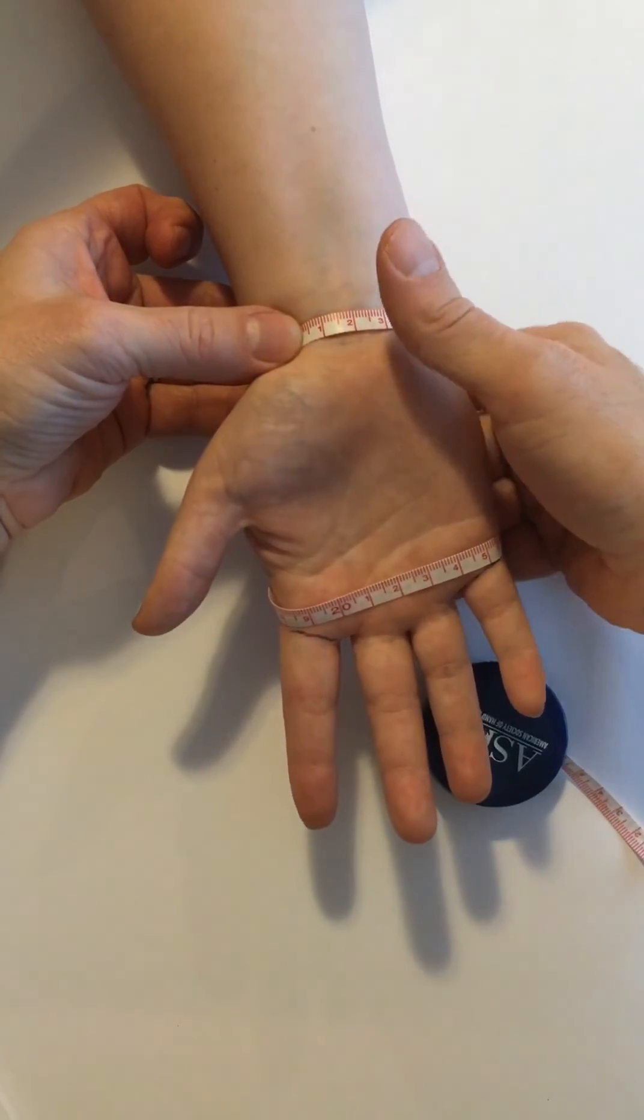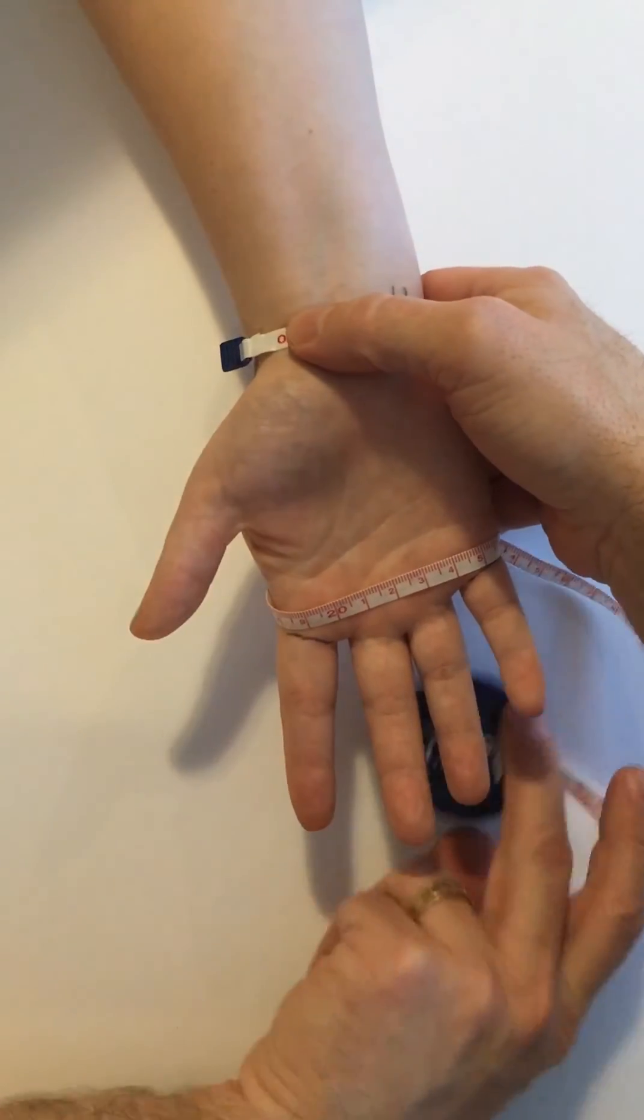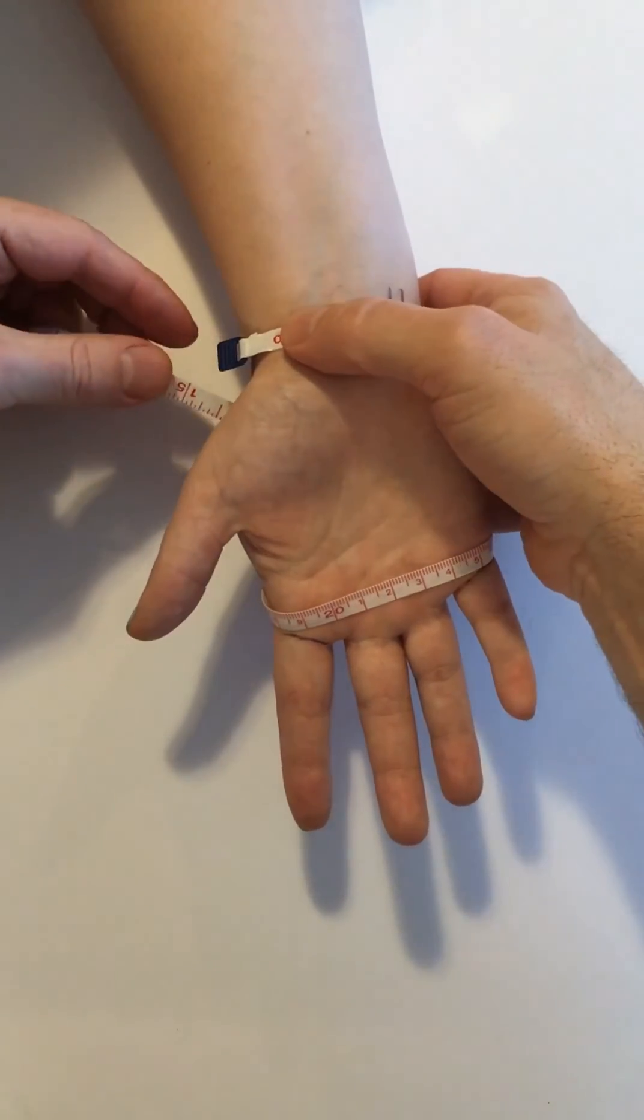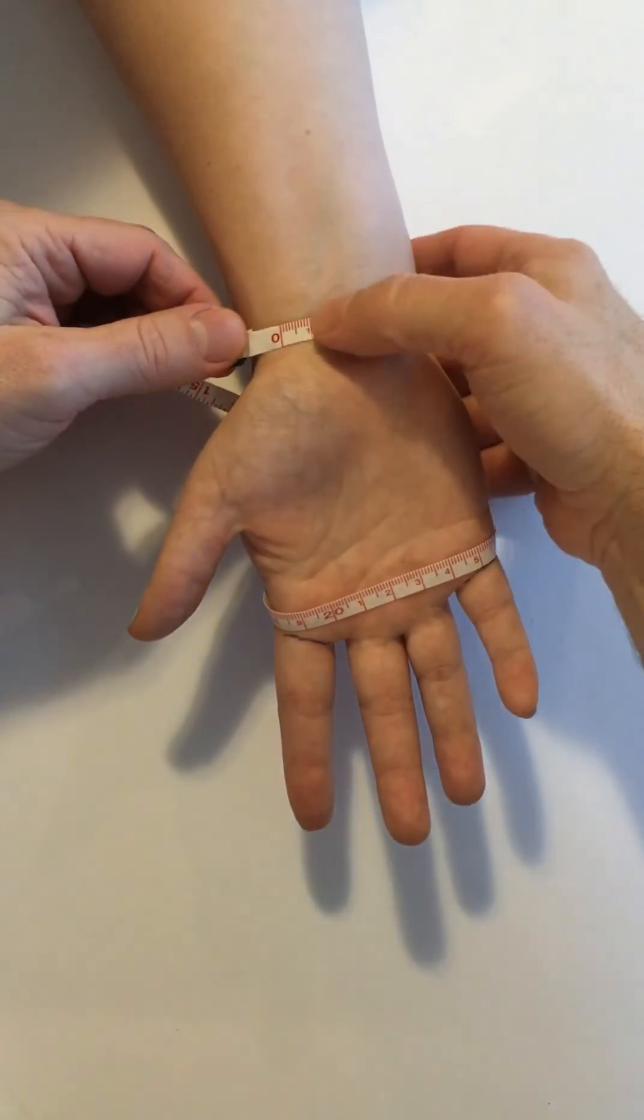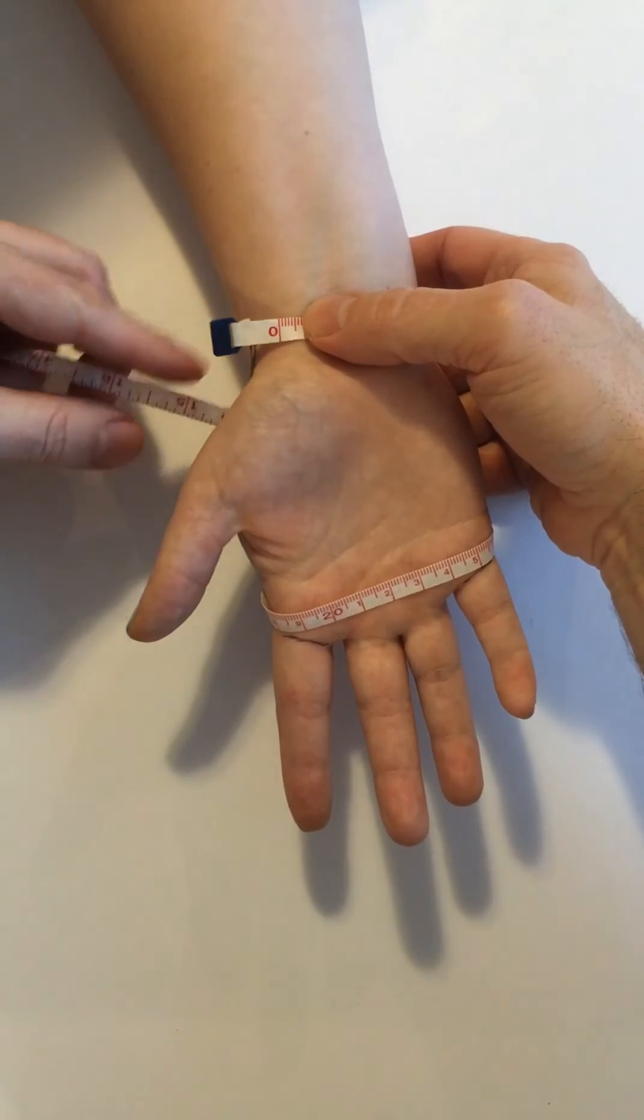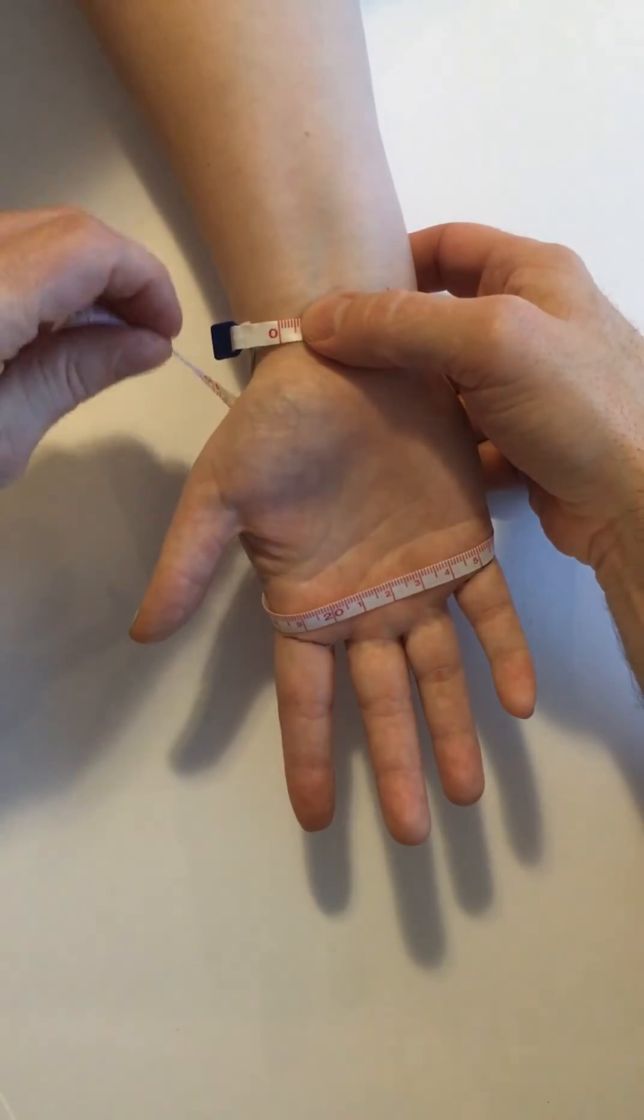Again bring it obliquely and proximally across the back of the hand so we come back to about where we started and cross the abductor pollicis longus tendon again.